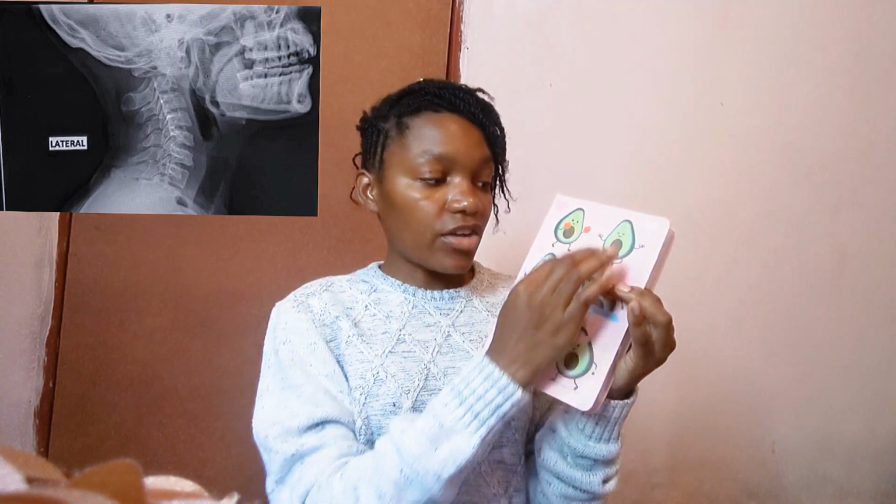So it's like when you put your hand here and you get a spray paint and spray here. When you remove the hand, it means that the spray paint didn't really penetrate my hand because it's denser. When I remove it, it's going to show the shadowing of where the paint penetrated. Definitely it's just on the sides of my fingers, and where it did not penetrate, it will show the shadowing, like the fingers, the palm and all that. That's how x-rays are as well, right? It's just going to show the shadowing of the object or the patient.